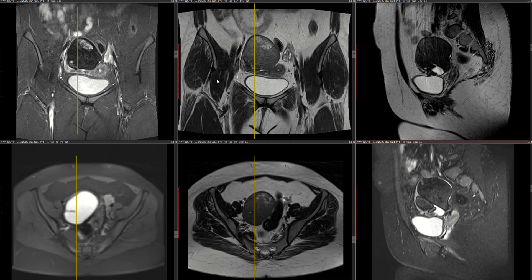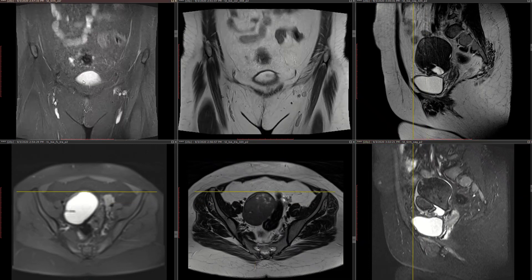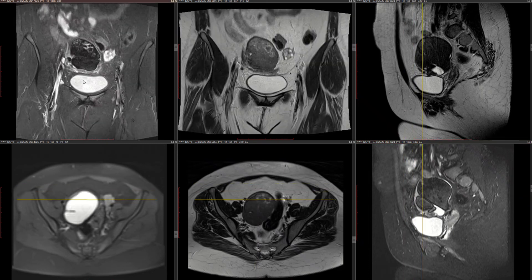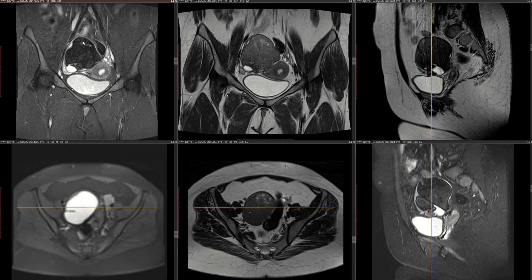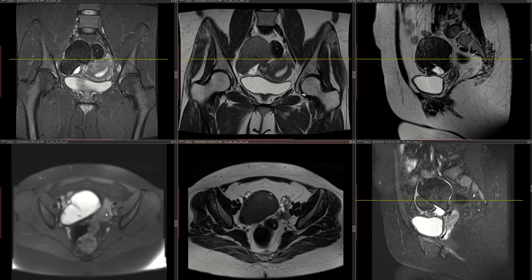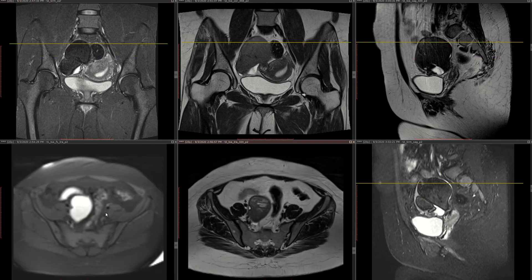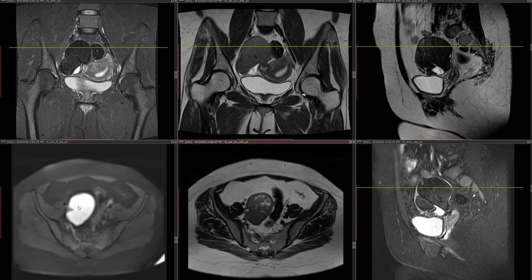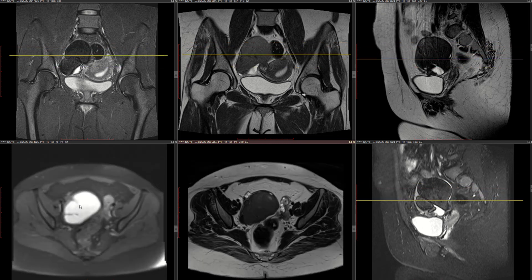A 23-year-old woman presented with lower abdominal pain. What we have here is a predominantly T2 hypointense structure, which is also hypointense on STIR, hypointense on plane T2 coronal and axial, and on T1 fat-sat images it is hyperintense.